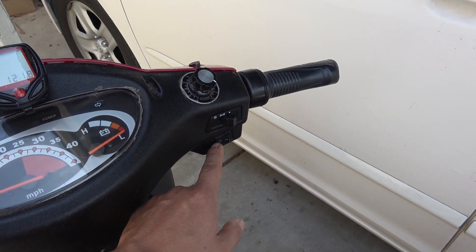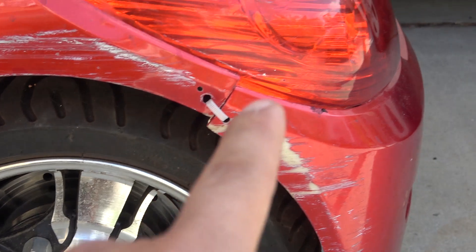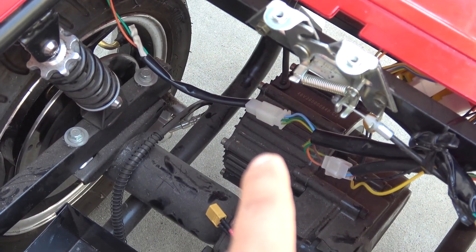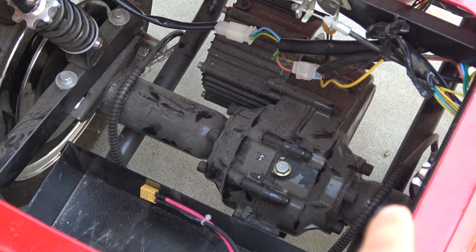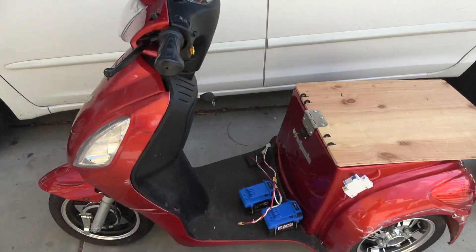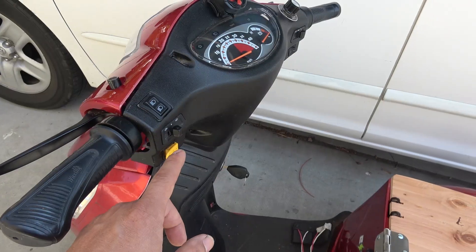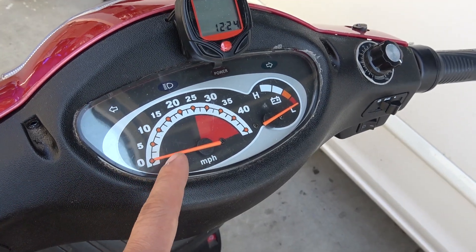It also has high and low beam headlight, forward and reverse twist throttle control, rear disc brake, and rear brake light. Inside the engine compartment you've got rear suspension, a 48 volt brushless DC motor, and most importantly a rear axle with differential. The whole electrical system on the scooter runs on 48 volts — all the light bulbs are incandescent and run on 48 volts, and even the horn is 48 volts.